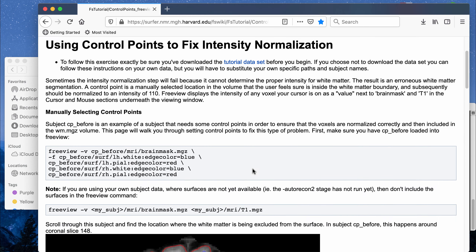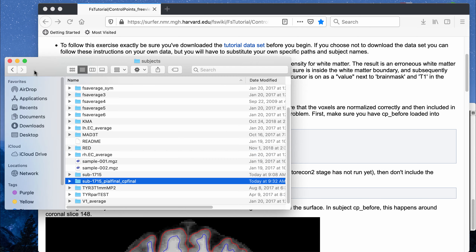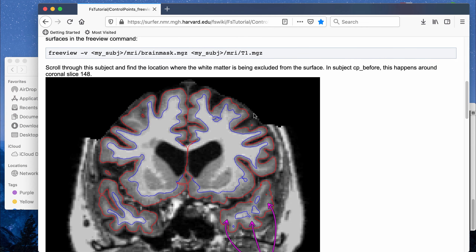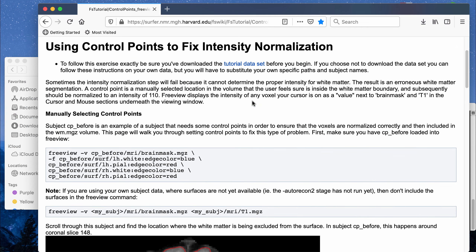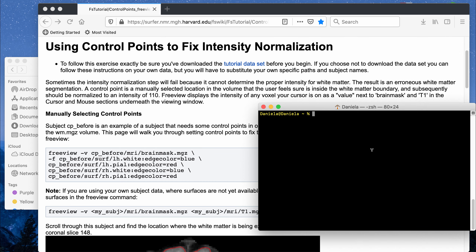I'm going to run this code — if you copy it and put in the name of your subjects folder that's in your FreeSurfer folder, it will open up the brain you want to edit in FreeView. I have that code copied with my correct folder named subject 1715, and I'm going to run it in a terminal window.